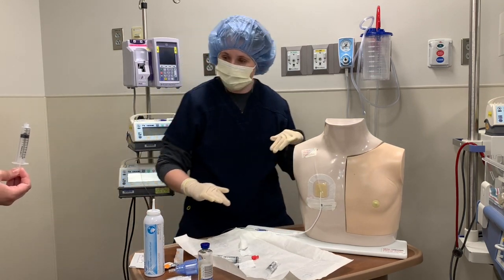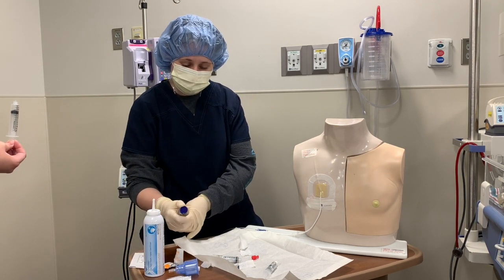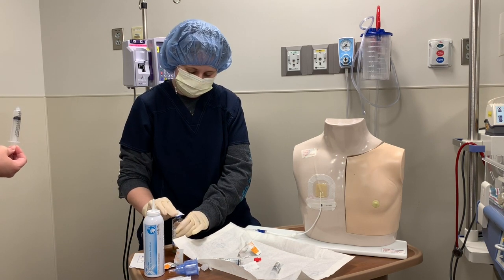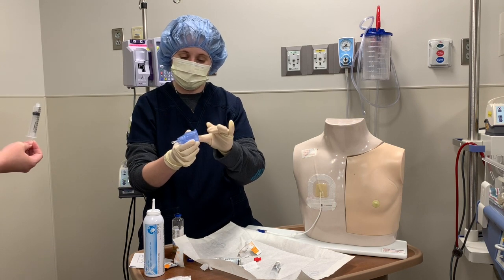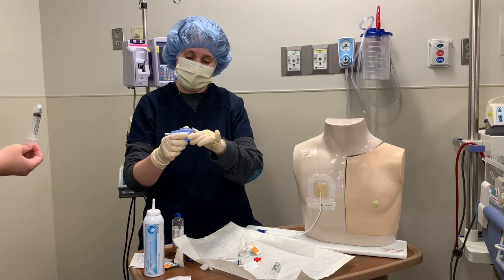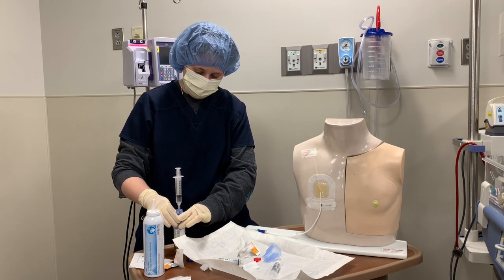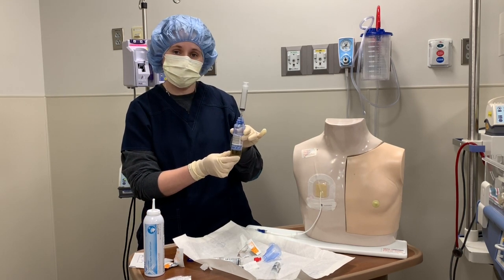As far as transferring the specimen: pop off the dust cover on the blood culture bottle and scrub it with alcohol. This would normally be in its packaging — remove the blood culture transfer device from its packaging. If it's not a fungal bottle, the top will be too narrow to fit on the tubing, so the top is removable to widen the opening. Take your blood specimen, screw it on without touching it, making sure not to contaminate. Then insert it into the blood bottle and it will suck in. Label with your Cerner bridge and send it down to the lab.